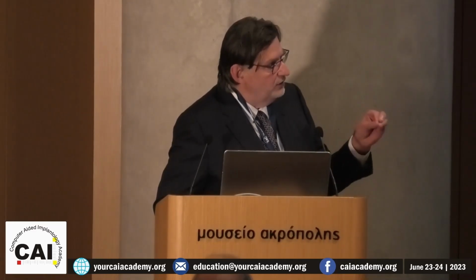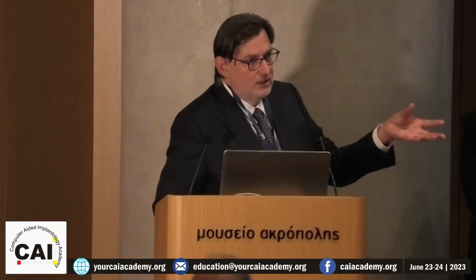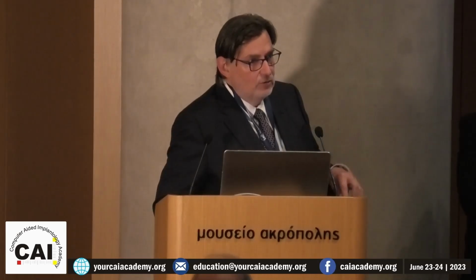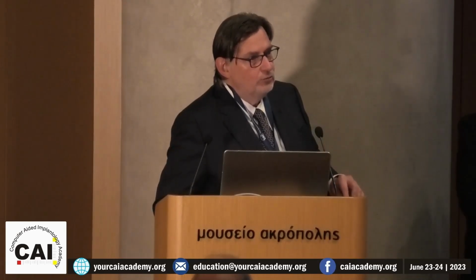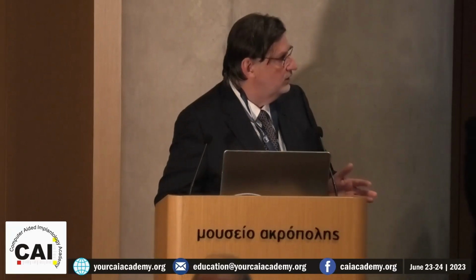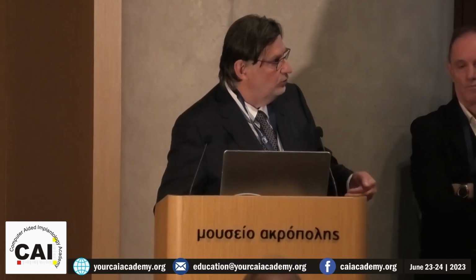The program, for instance, also takes the clinical pictures in and takes the apicals in and puts them automatically. So when you click on a tooth, you get the clinical image. You have to do nothing. It's automatic with artificial intelligence. So for me, artificial intelligence is a slave. It's not my boss, it's a slave. But it can save us a lot of time.